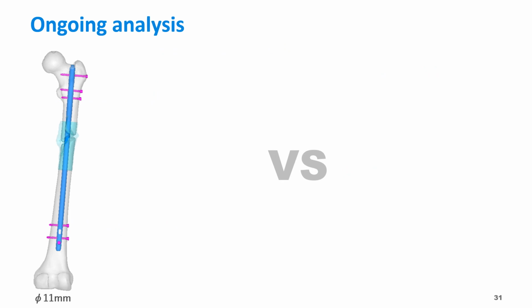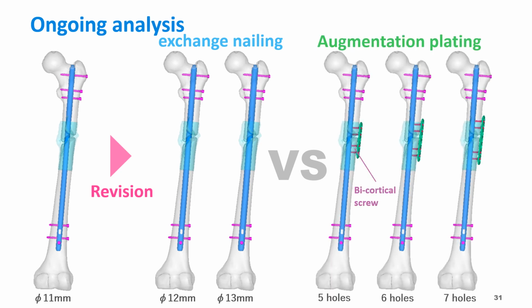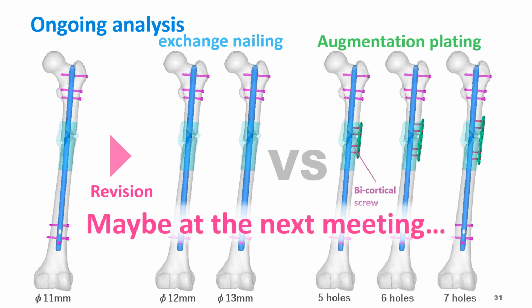Now we are comparing the models for revision surgery, exchange nail, and augmentation plating. We'd like to show them at the next user meeting.